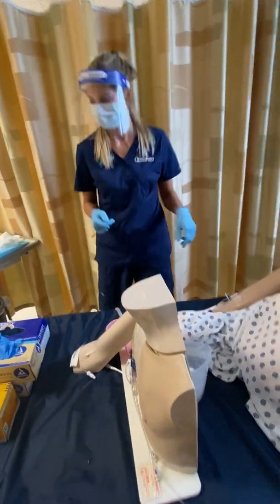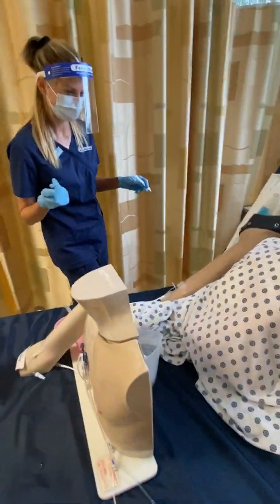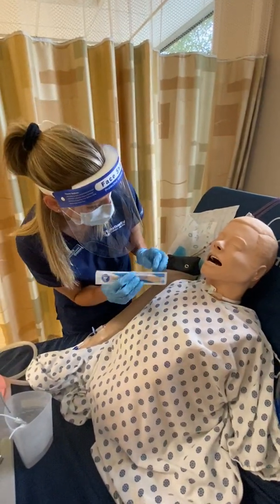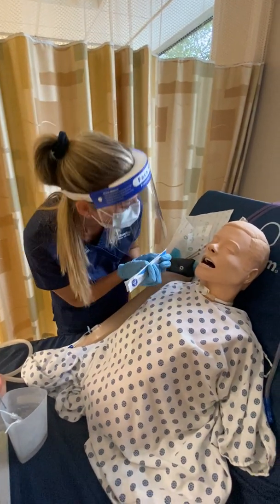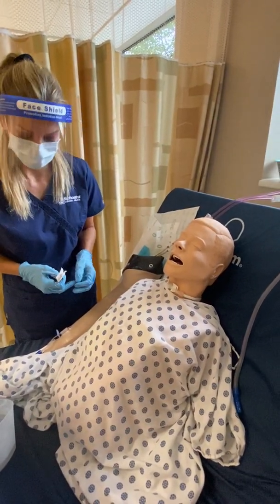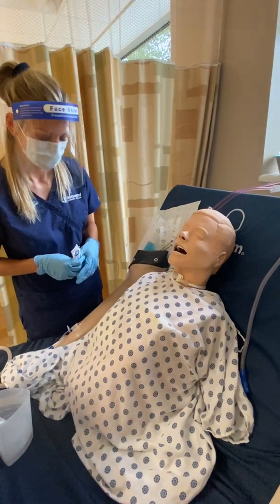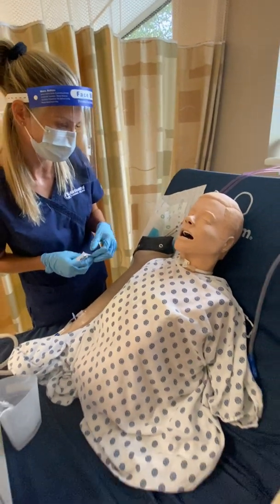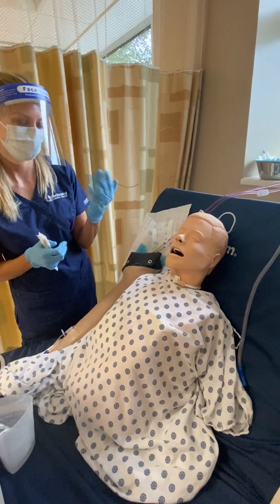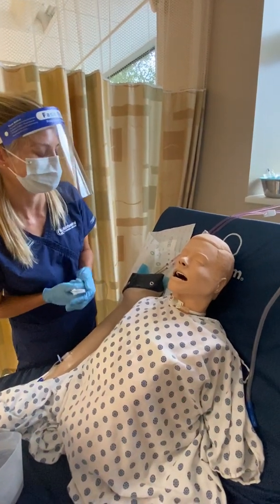Okay, all right. So, Jane, I'm going to check your nose and make sure that your nares look good for your NG tube. So I'm just going to check inside your nose, see if I can see anything, check your mouth. You are NPO, so I won't be able to give you any water to help swallow the tube down, so we're just going to have to swallow dry once I stick the tube down your nose, and it'll go down your throat into your stomach. But I'll guide you through it as we're going. So I would probably put gloves on at this point, because if you're touching a patient's face, you probably would want to wear gloves.